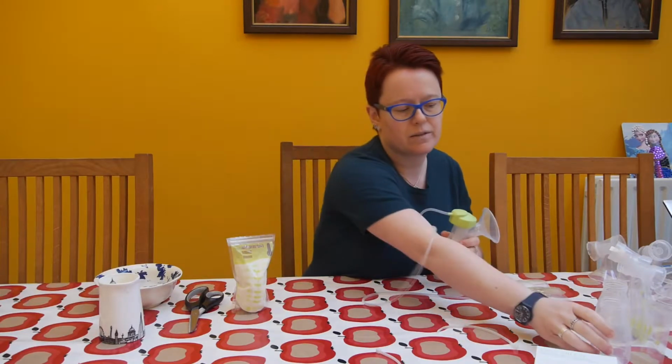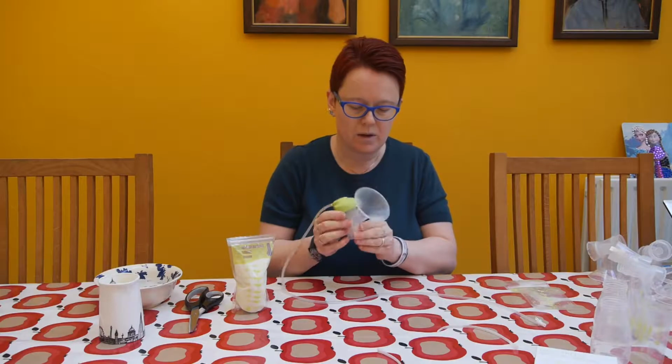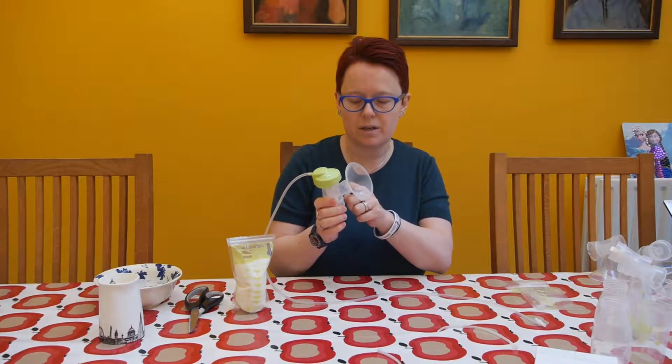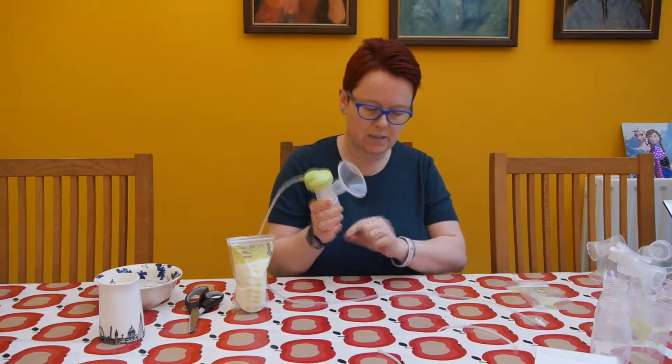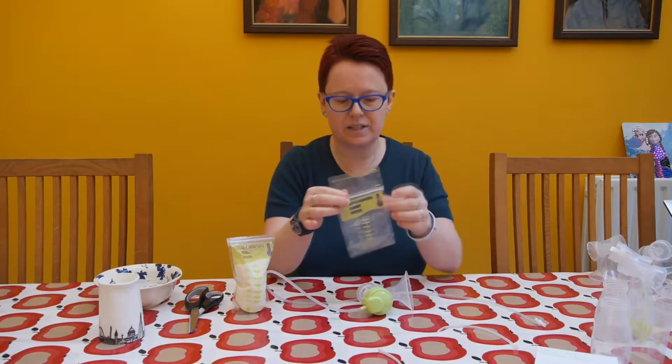So let's take that off the end of the breast shell. We're going to attach the bag directly to the bottom of the breast shell. So when we pump, it's going to go through the breast shell and straight into the bag through the little valve. So this is our Easy Freeze bag.